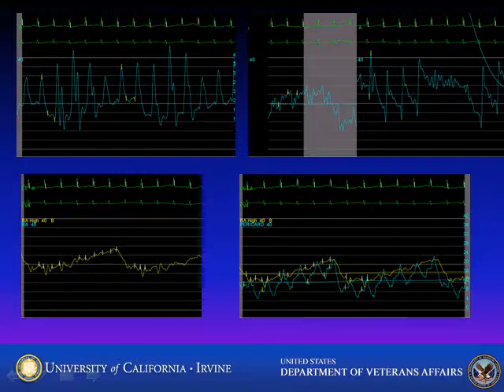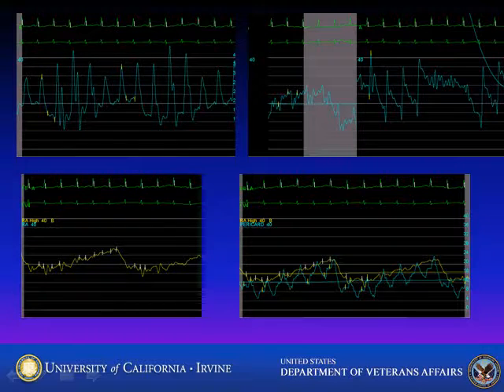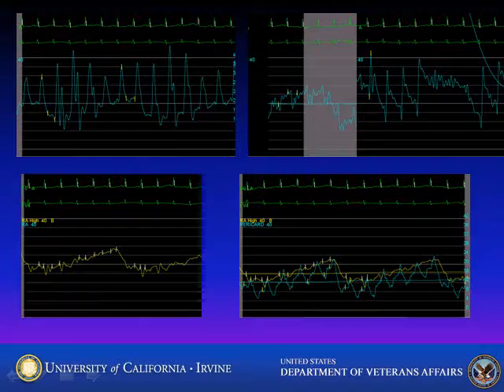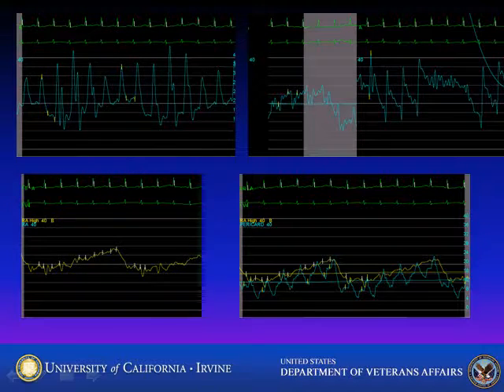On the lower panel left, we see the right atrial pressure with respiratory variation and absence of any phasic waveforms. On the right side, after a few milliliters of pericardial fluid is removed, the pericardial catheter now recording pressure in the blue tracing shows that at times the pericardial pressure exceeds atrial pressure, accounting for the collapse of the right atrium wall during diastole.